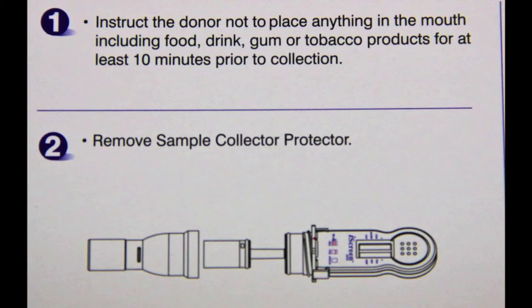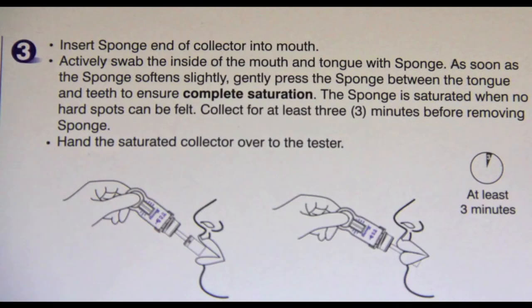Next, remove the sample collector protector. Then have the person insert the sponge end of the collector into their mouth and swab the inside of their mouth including the tongue. When the sponge softens, they should gently press the sponge between the tongue and teeth to ensure complete saturation, so no hard spots are felt within 3 minutes before removing the sponge.